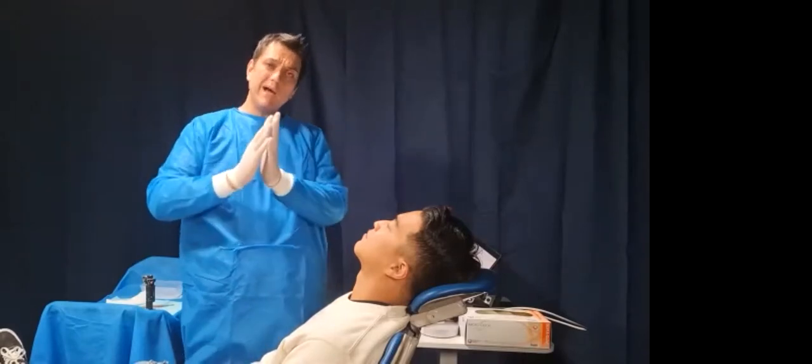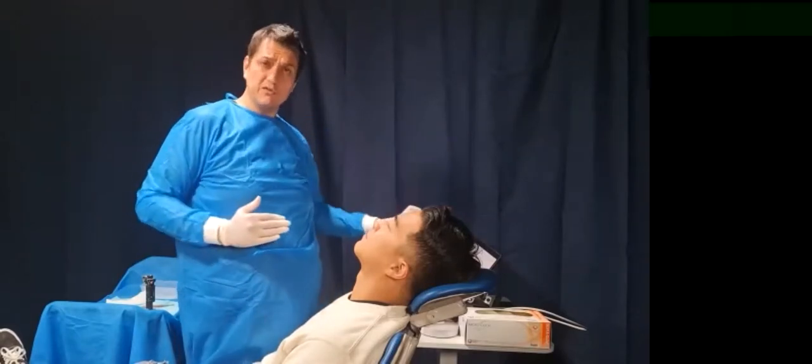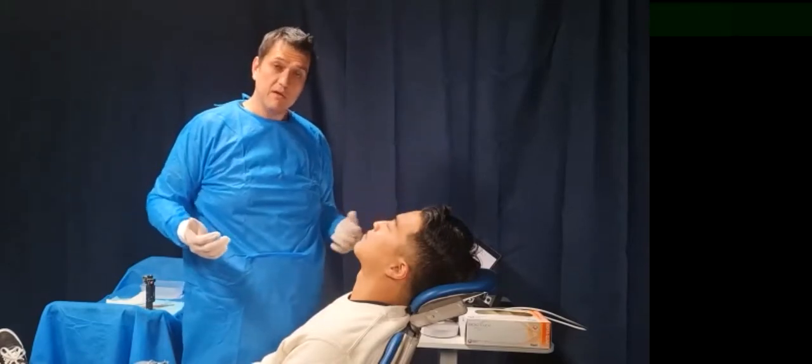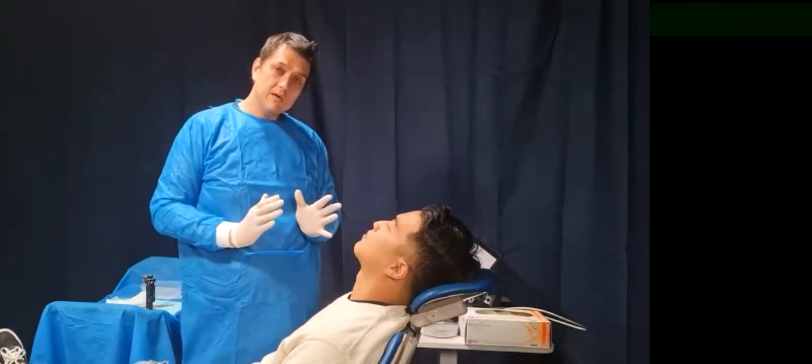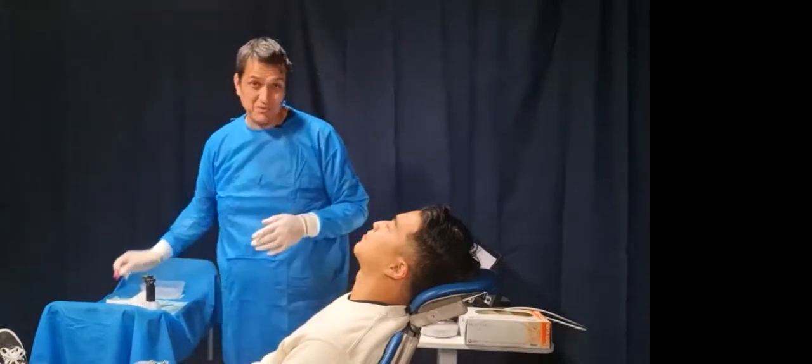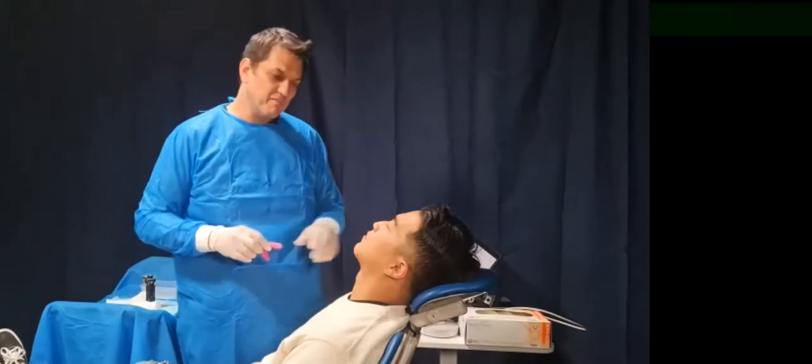So if you've got wax covering the entire buccal surface and you've already done your scans of the upper and lower, you will not get a record. It will not come together. But if you've cut away the wax and it's very, very clear, then you will be able to get a record, which hopefully works right now when we do it, right? Again, it's always tricky when you're going live to get these things working, but I think I'm pretty confident. So opening up for me.